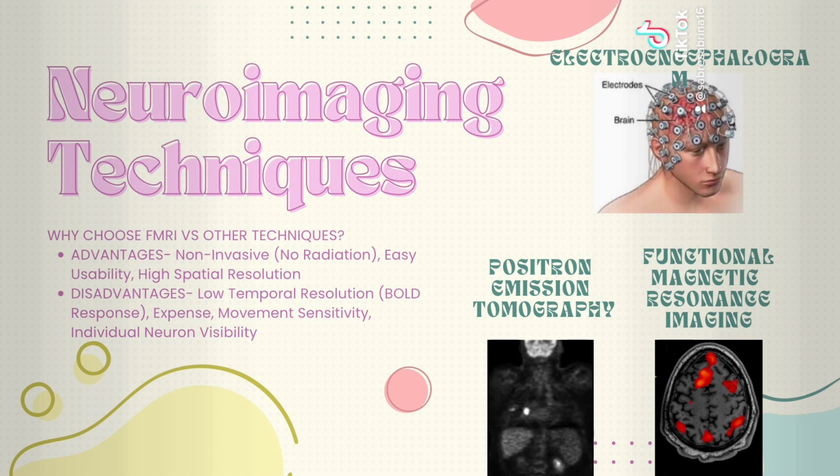A big disadvantage of fMRI that restricts its accessibility is that it's highly expensive, with fMRIs costing around $3 million. In contrast, the standard EEG typically costs $200 to $700. Plus, while with an EEG you can move a bit, the person being scanned with an fMRI must stay completely still in order to capture a clear image.